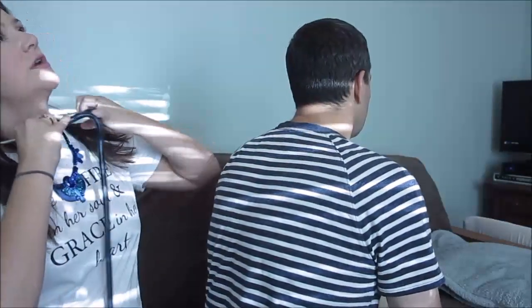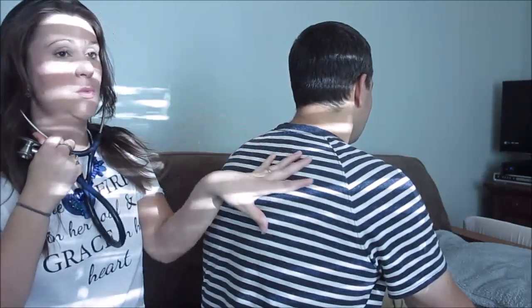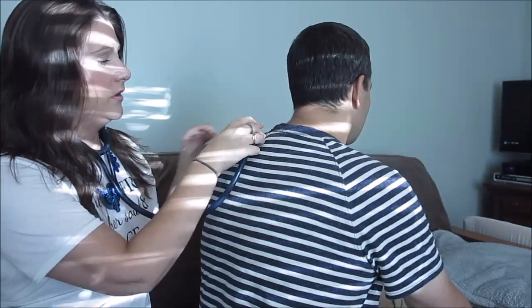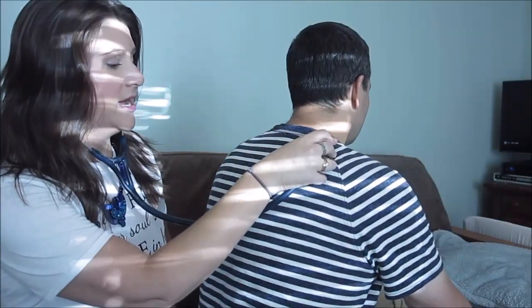All right, so let me show you where to put your scope. And I always, when I'm listening to breath sounds, I ask my patient to breathe through their mouth, because that's going to amplify the sound. All right, so I'm just going to show you where to put the scope. I'm not really going to have him breathe or deep breathe or anything like that. But you would start kind of high up here. Side to side.